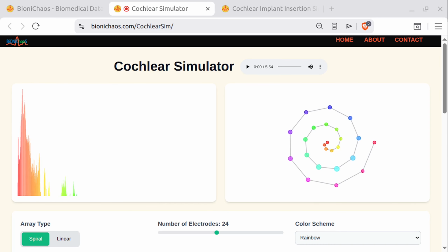Which is why there are protocols. For years, patients have had to undergo an actual surgical procedure under local anesthesia just to have their implant's magnet temporarily sliced out of their head, get the MRI, and then have it surgically sewn back in.